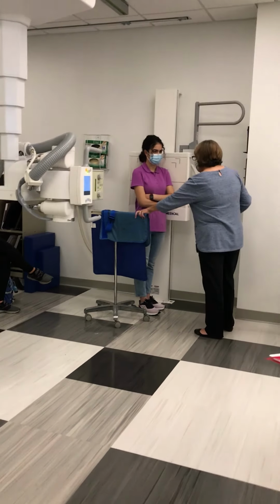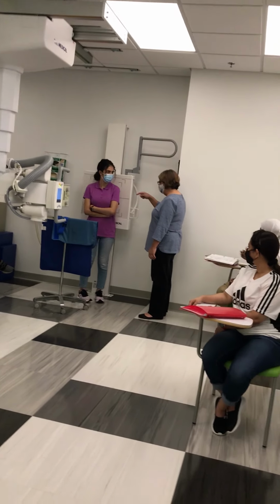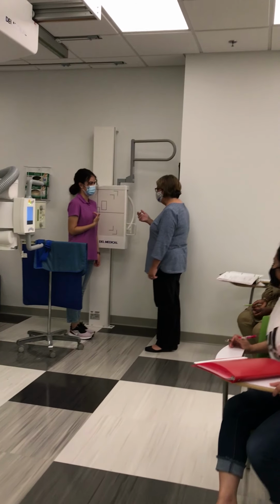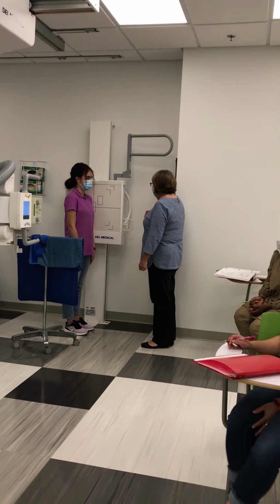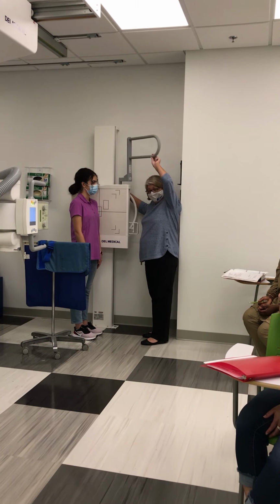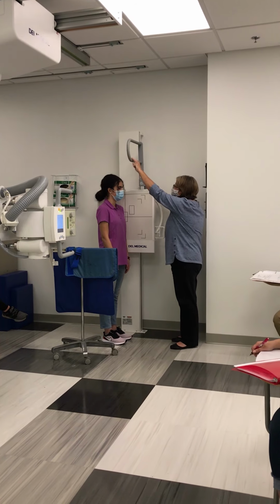Okay. For the lateral, I want you to turn and place your left side against the board. Turn and face me. Now I'm gonna move this handle across. There's a knob back here that I pull out to release the handle.